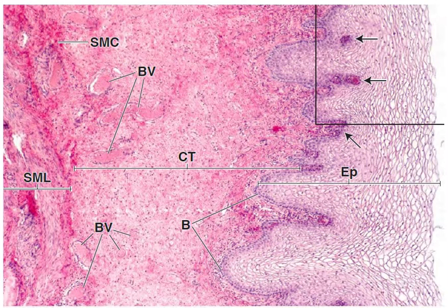The epithelium does not keratinize, and except for the deepest layers, the cells appear to be empty in routine H&E stains. So you can kind of see that here. The mucosa contains neither glands nor muscularis mucosa, and the muscle is smooth and not well ordered. This should be contrasted with the oral cavity, pharynx, and upper part of the esophagus. We don't care about that right now.